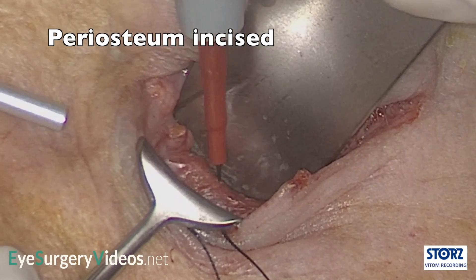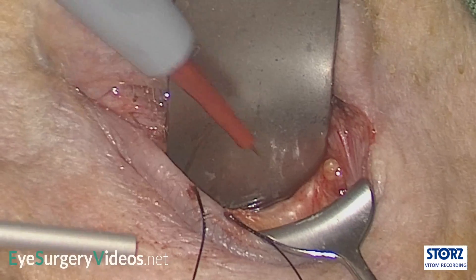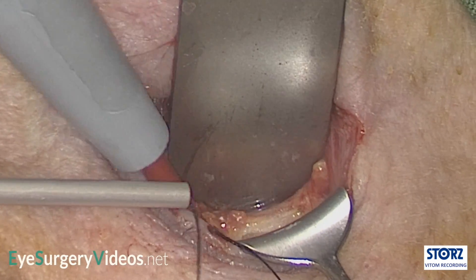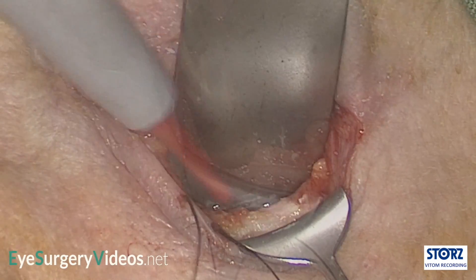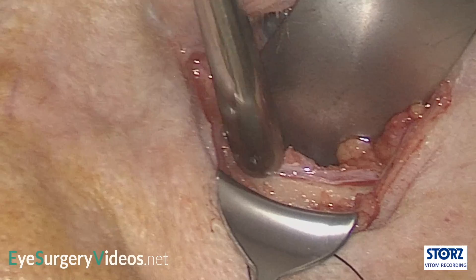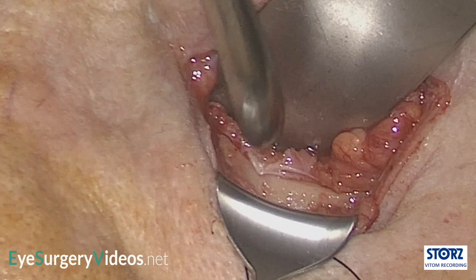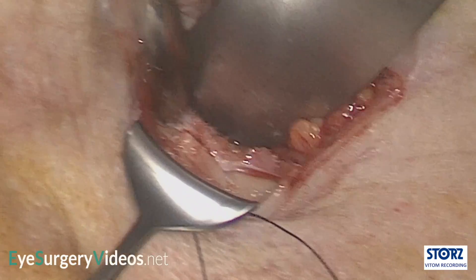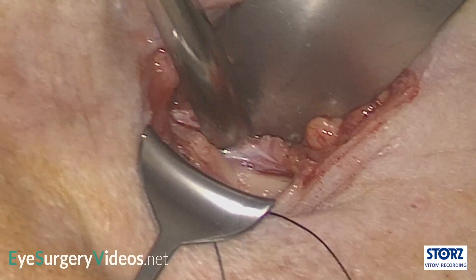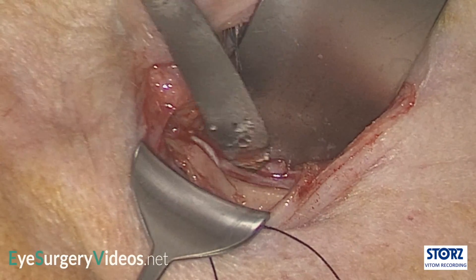Great care must be taken medially in view of the presence of the inferior oblique. The orbital rim and the orbital floor are gradually exposed. On closure, the periosteum can be sutured and the tarsal conjunctiva can be repaired with 7-0 vicryl. The lateral canthus is then reformed.